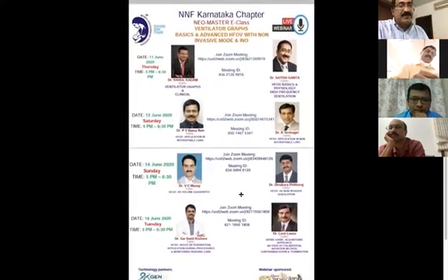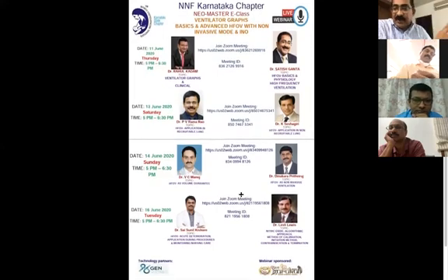Depending on that, if the blood gas is much, much better, I would even think about reducing the amplitude, or if it's bad, I don't mind considering going up. So very good question. It's a practical question.